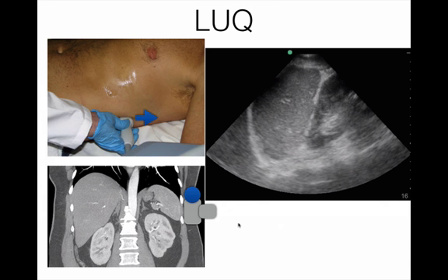And what you really need is to have this nice spleen where you have the lateral part of the spleen and the medial aspect of the spleen, and it should look like a tongue sticking out at you. And so this is spleen, this is kidney, this is the iliopsoas right here, and you have that splenorenal recess or potential space. You have your diaphragm above here and here, and then you have your vertebral bodies again that look like a series of arches or humps.